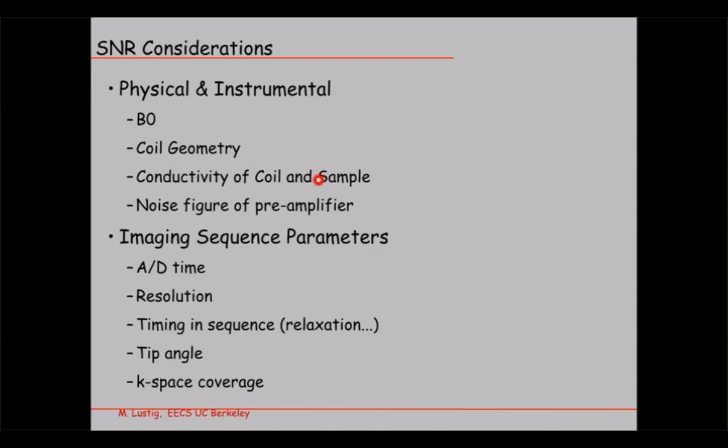But also the sample that you image itself may also be conductive. And is that true for humans? Are we conductive? Unfortunately, yes, right? Because we can get electrocuted, which means that current will go through us. But at the same time, the heart kind of works that way. And there's other things that are really useful in order to do conductivity. For example, the fact that I'm moving my hands, there's electrical signal moving from here to there and back and so on and so forth, right? So that's important. But that can also cause noise in the image as well. So the sample itself may actually generate noise.